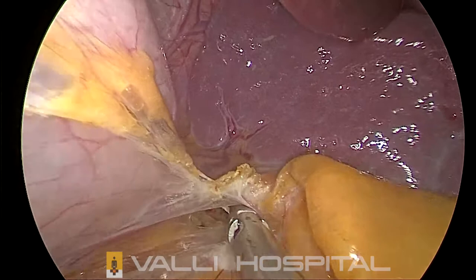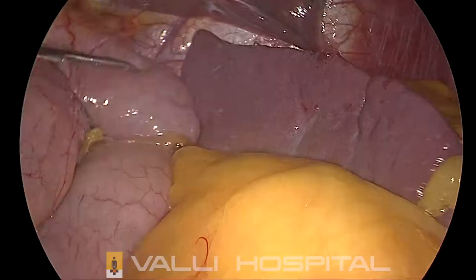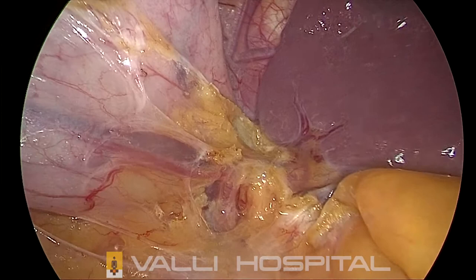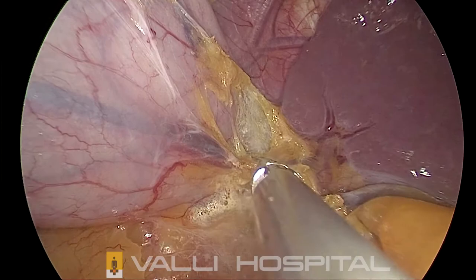Here you should not use a diathermy. It's very, very important. Harmonic scalpel is a better instrument when there is no gap at all because you can't err on the spleen or on the stomach. See, the assistant holds the posterior wall, the surgeon holds the anterior wall. Then only you will see this area very well. See, there is a big vessel. You coagulate nicely before dividing.